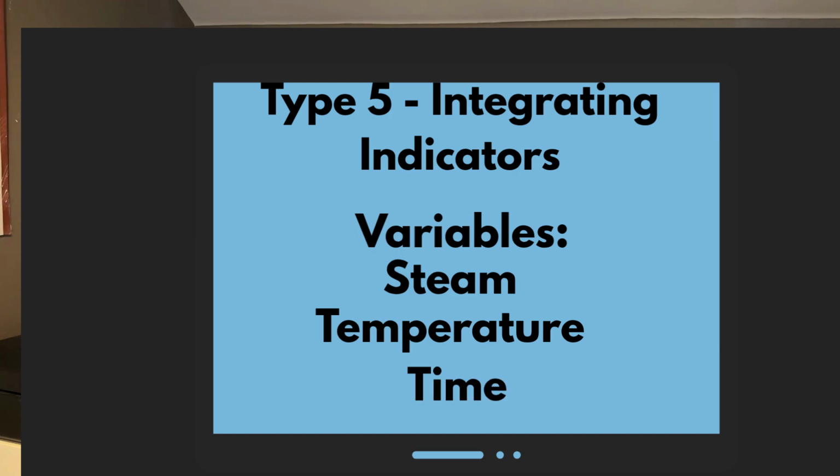All 3 of these must be met before that indicator changes. Type 5 indicators are designed to correlate closely with the performance of a biological indicator, which we'll talk about in the next session. In other words, the indicator is calibrated so that it only reaches a passing result when the sterilizer conditions have met all 3 parameters and can kill a microorganism contained in the biological indicator.